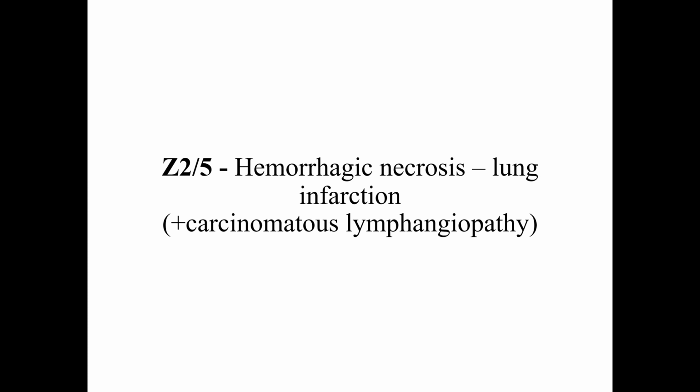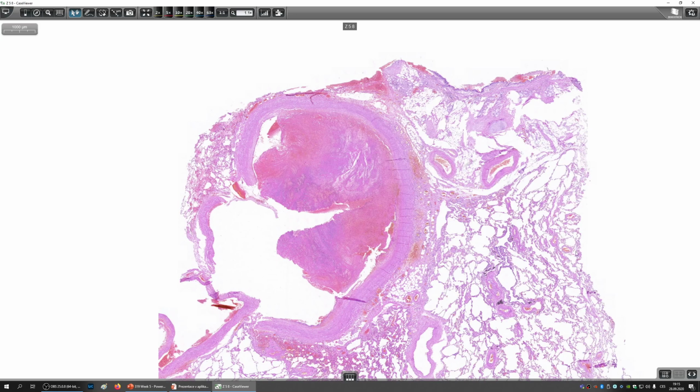And a combination which you might see is a recent thromboembolism plus chronic heart failure. So you need to have something like this, or a hypercoagulative state. So in most patients, even in those who had a very big pulmonary thromboembolism, you're not going to see lung infarction. You need something more to it. In this case, this is going to be a very nice case, as you will see.